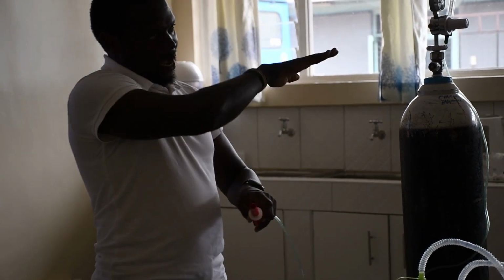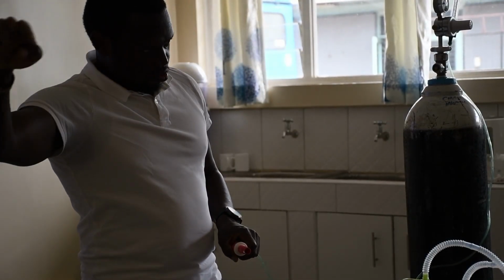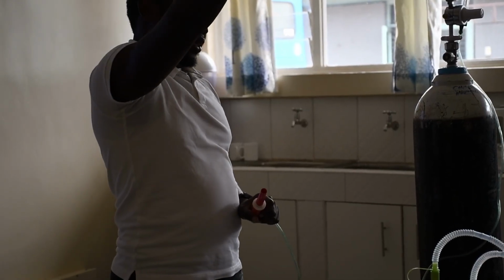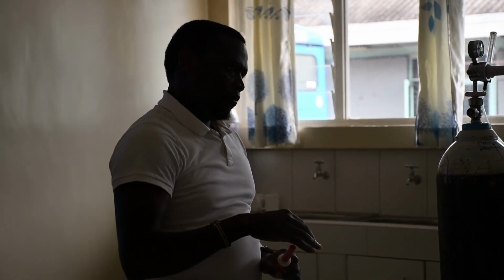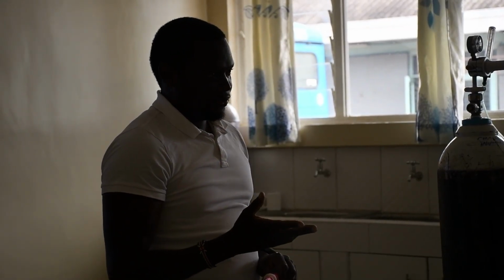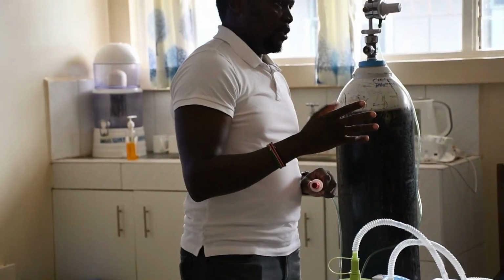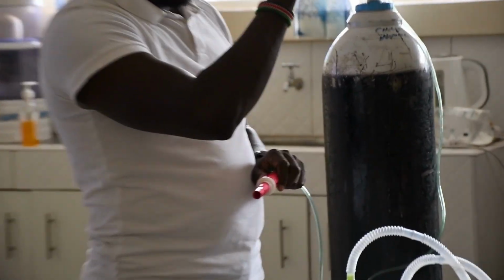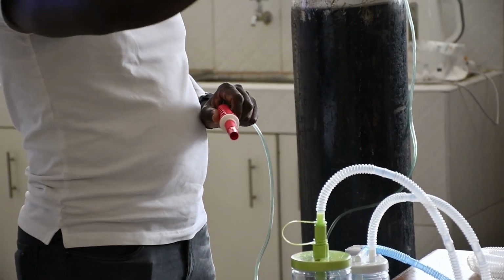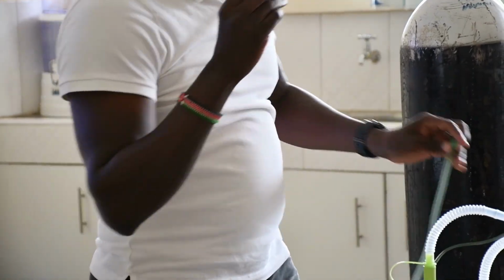So if I have two zones, one a low pressure zone and the other a high pressure zone, where will the gases flow? From which zone to which zone? High to low. Okay? The laws of physics dictate that there's no way the gases moving in the low pressure zone are going to flow in the opposite direction. So that's what happens in this blender.